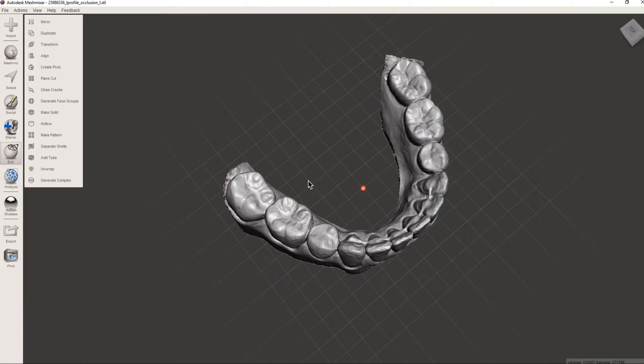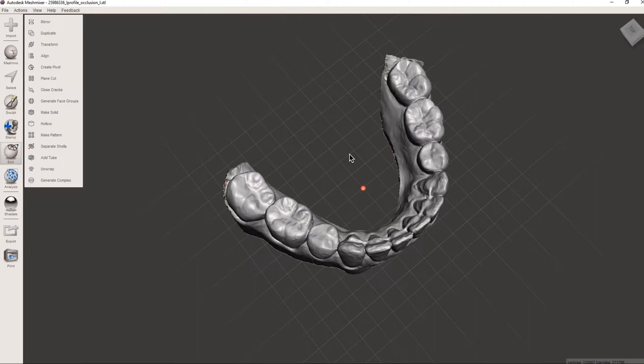This is Dr. Eric and I want to review how we take a model that's been exported from the iTero with a solid base and basically get it ready to print without hollowing.